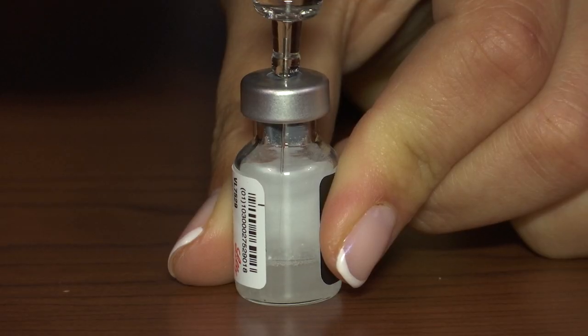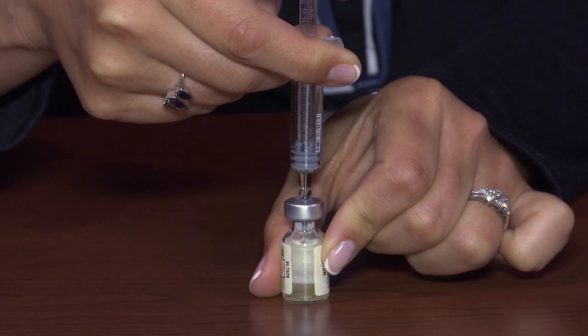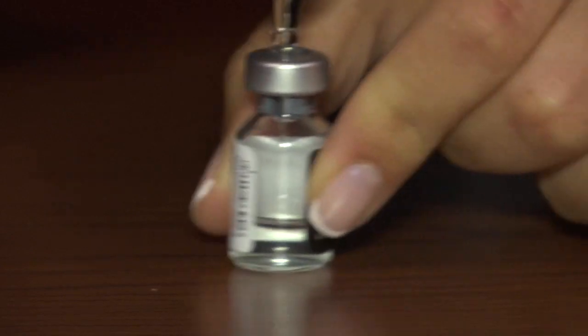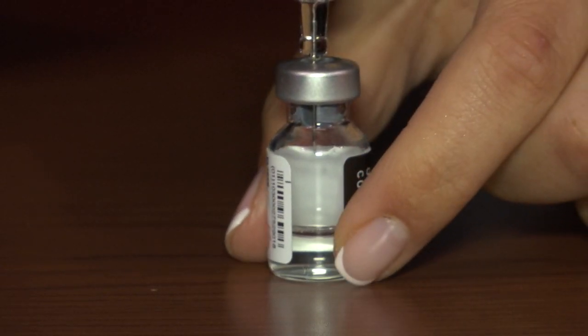Then inject the sterile diluting solution into the vial of powder. Do not remove the needle. Mix the solution by hand. Do not use the Glucagon until the mixture is clear and the solution has a water-like consistency.